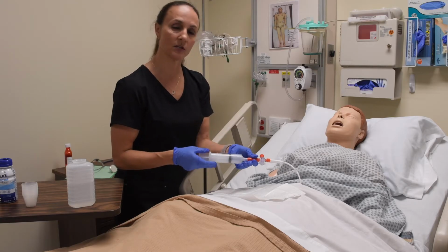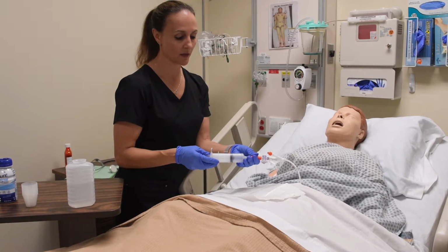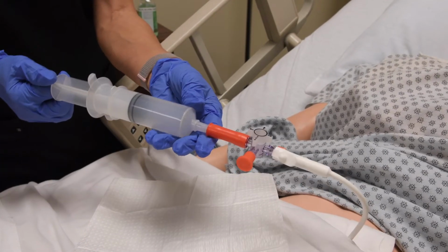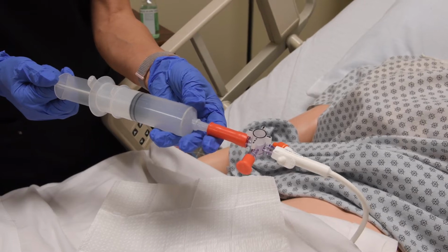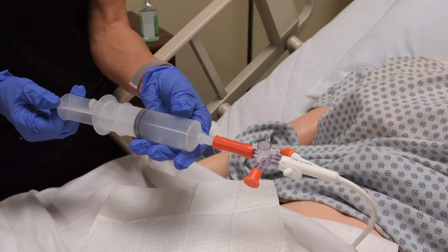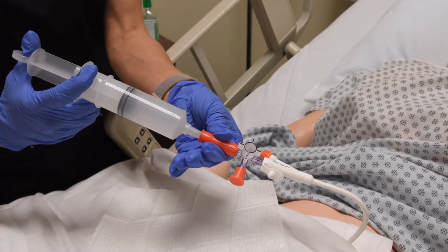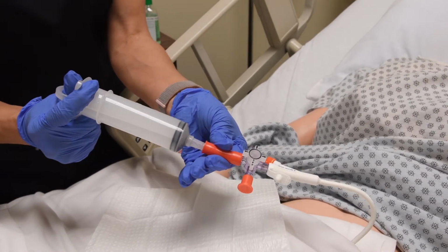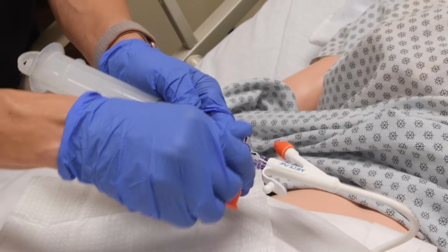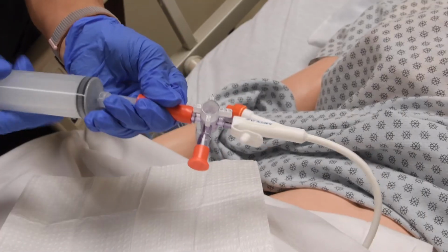What you will need to do is make sure that you're assessing the residual. You need to check your facility policy to see how much is too much. I want to assess the residual and aspirate for the color, consistency, and amount. You would hold the tube feedings and medications if the residual is greater than 200 mLs or according to facility policy. Return the residual to the patient because this is the patient's feeding and it also has electrolytes. Turn the feedings off to the patient and take off your syringe.